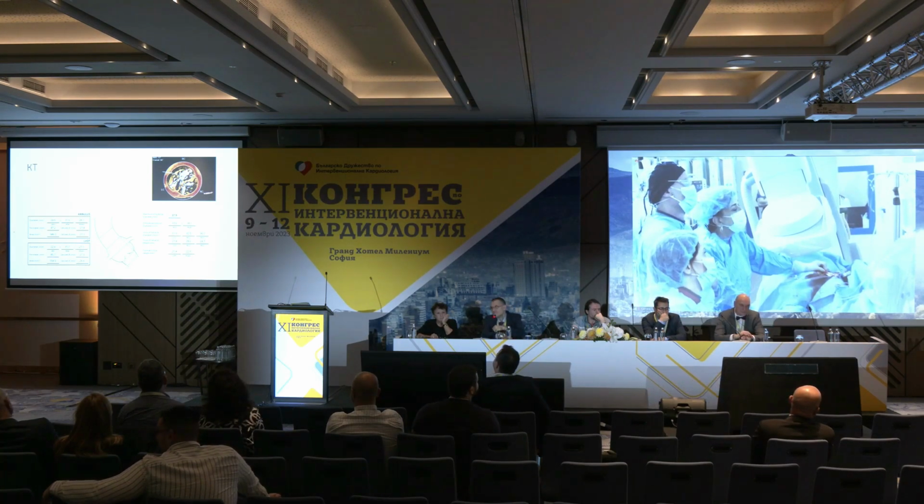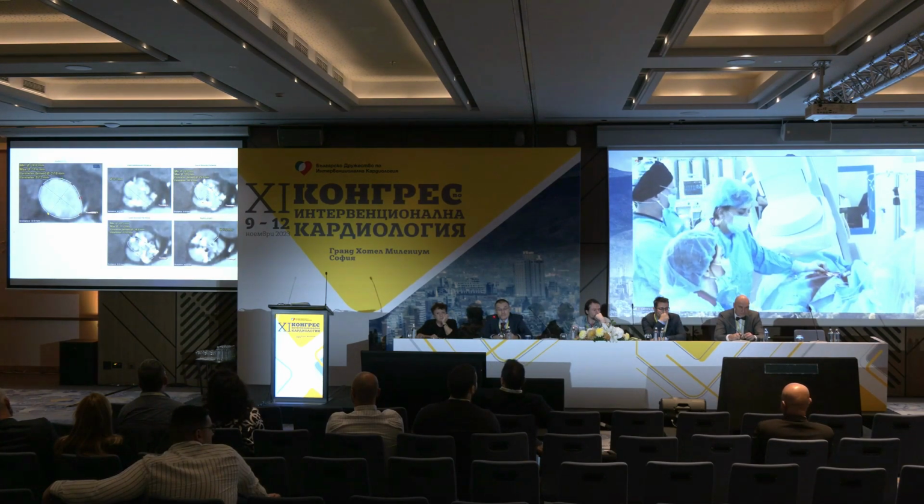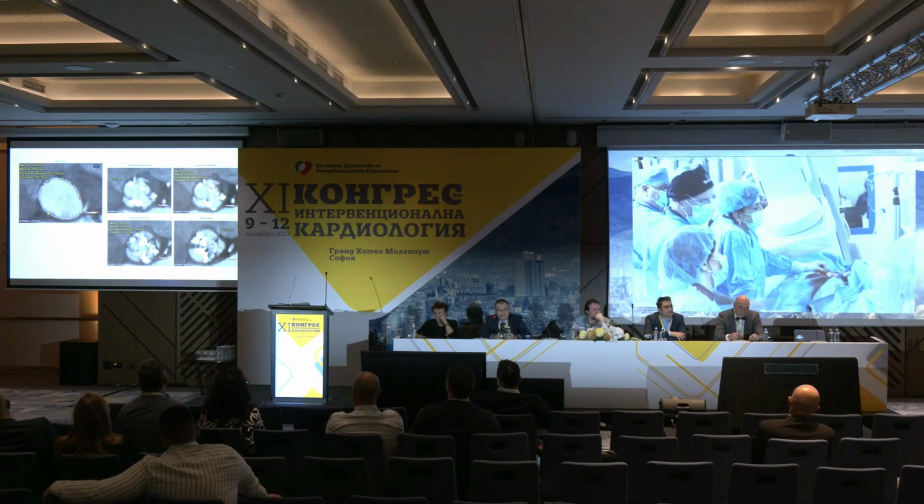According to the sizes, we decided to, with patients with bicuspid aortic valve, it's a bit tricky to decide the size of the valve because firstly, we usually use the size of the aortic annulus, but it's important to assess also the intercommissural distance on the supra-annular level.